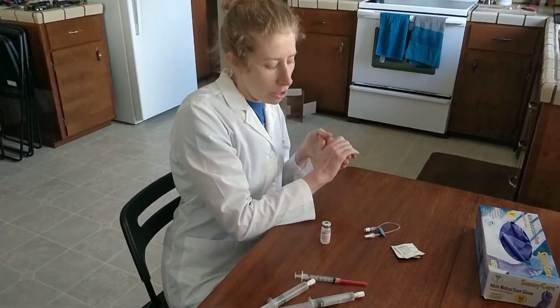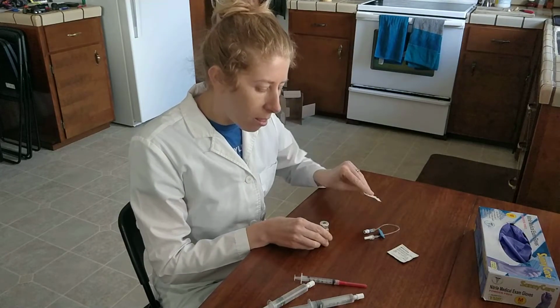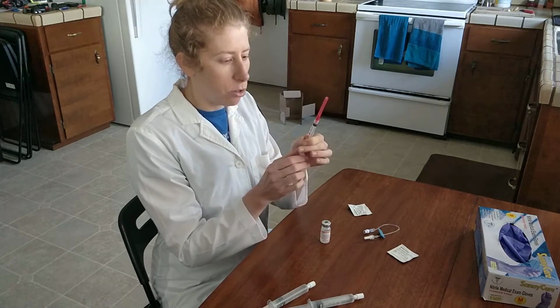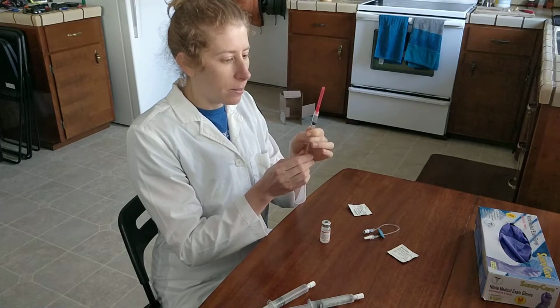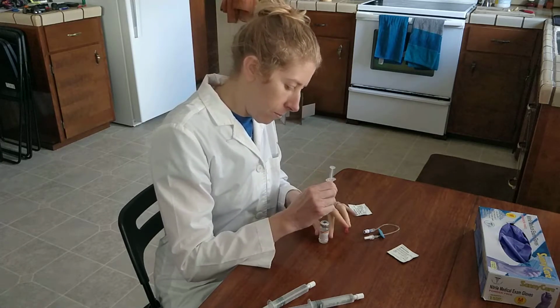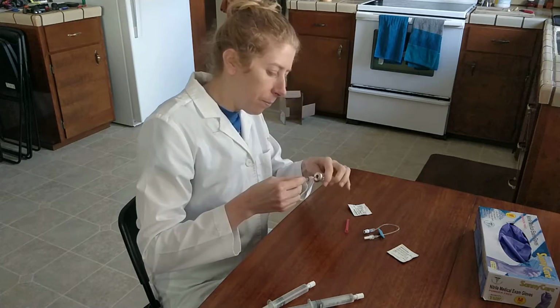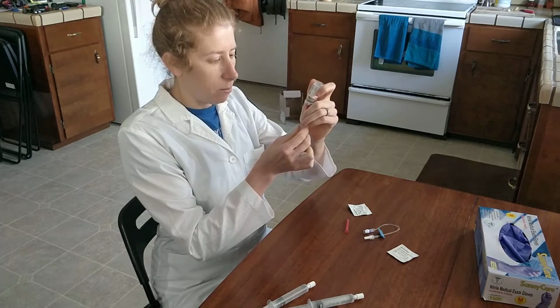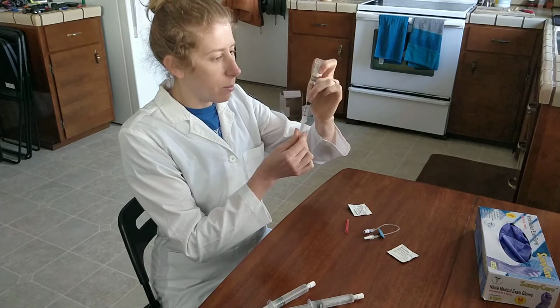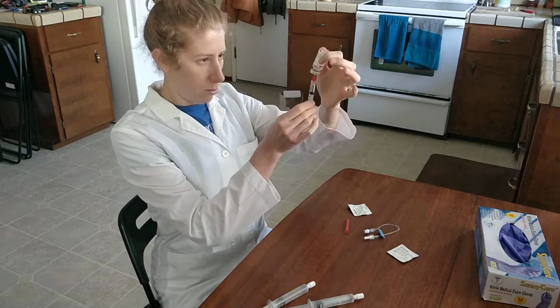I will perform hand hygiene again. Remove the top of the medication, cleanse the vial, allow it to dry. We'll make sure that the needle is firmly attached to the syringe. Draw up the same amount of air as medication to be administered. Inject the air above the medication line. Invert the medication and draw up the correct amount of medication, verifying that there are no air bubbles and that I have the correct amount.